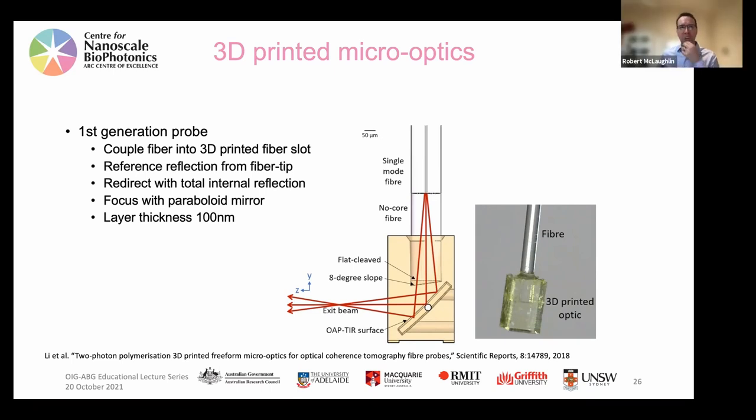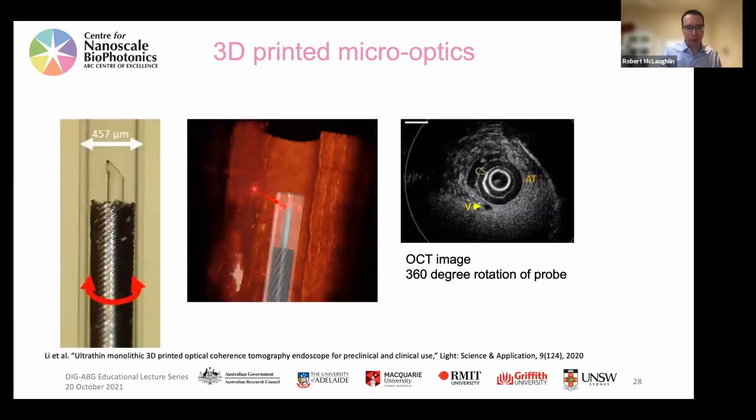So for imaging inside the plaque is more challenging because we don't want to poke our fibers into there. The model here will be we have the small optical fiber in a catheter. Let me go to a picture of one of those, which we thread inside the blood vessel, and then we shine the light inside the plaque. Some of the work that we're doing is we're looking at different types of fluorescent sensors that will bind to particular things, like be taken up by macrophages, so that we can shine light into the plaque. And if it glows a lot, we know that it's a particular type of plaque.